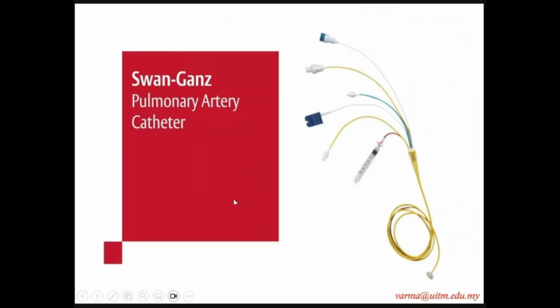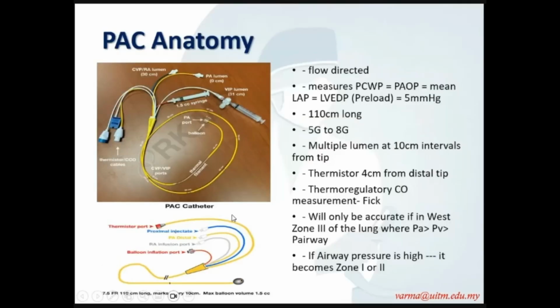Next, another thing that you all have to know is the Swan-Ganz catheter: just the anatomy of it and how to use it, what are the few methods to use it, and complications. No SAQ, but MCQ is quite famous. Okay, we go very brief.